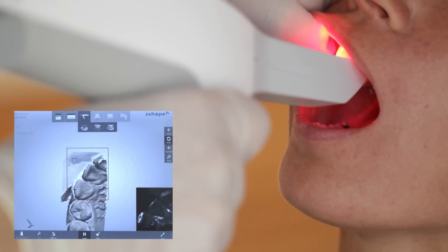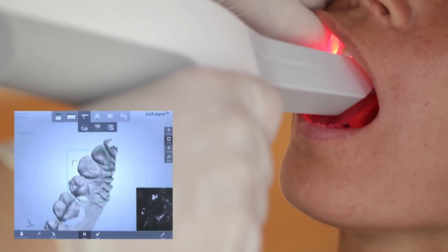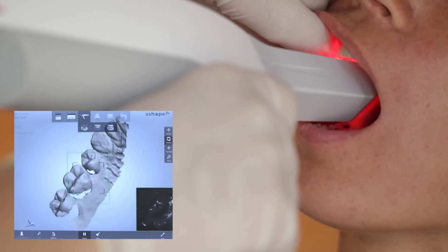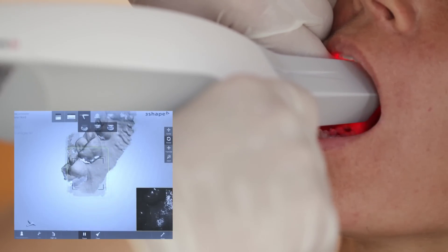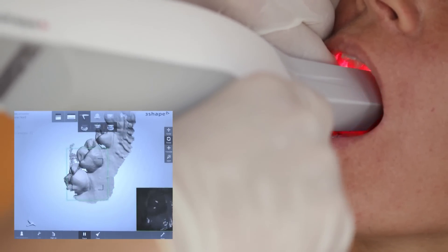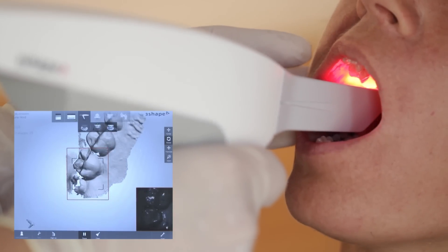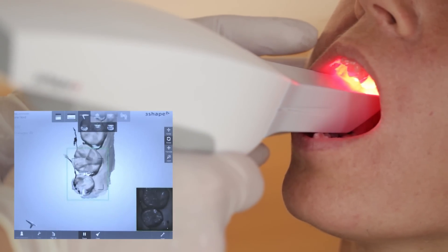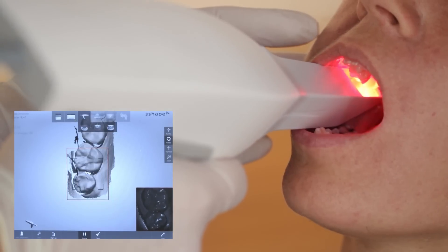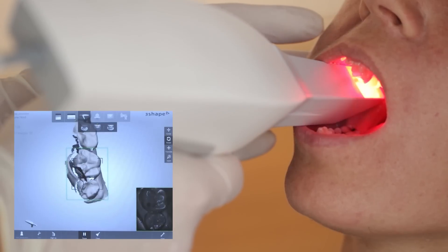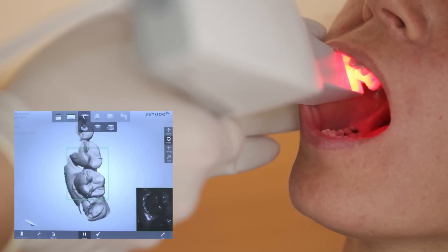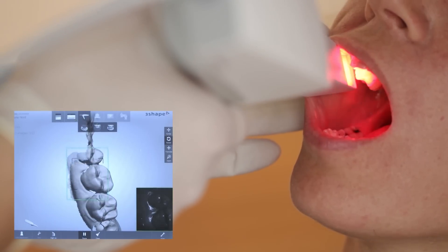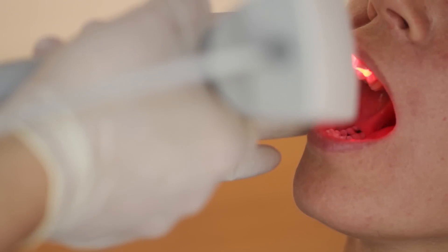Scanning must always be completed using three passes: occlusal, lingual, and buccal.